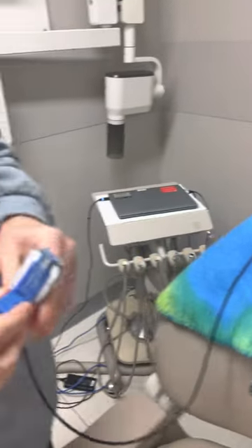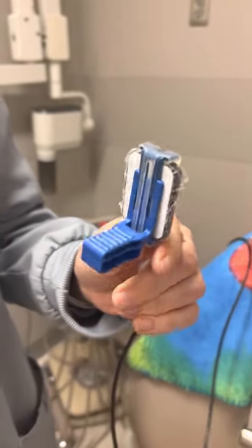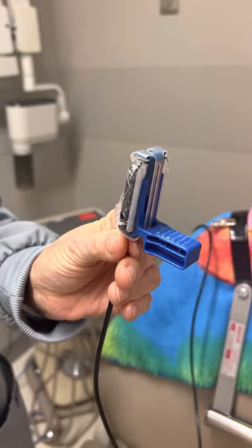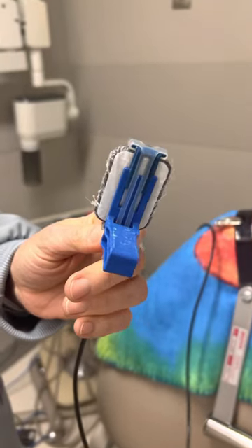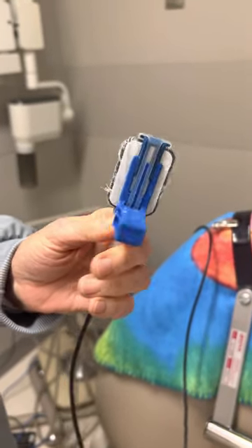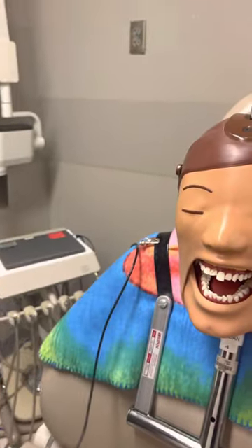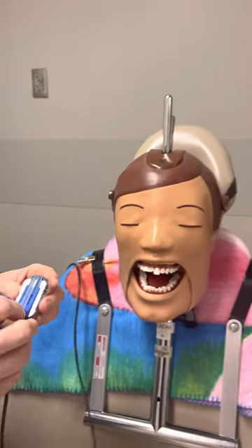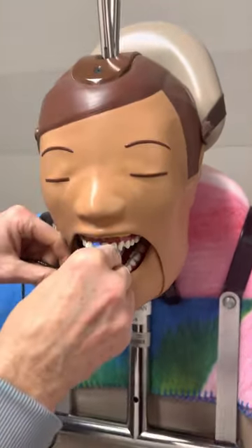We're talking about bisecting. We're going to start with the anterior holder. The anterior holder can be blue or white. You just have to make sure that you check the orientation of the holder. For bisecting, we're not going to have that arm and that ring, so we're going to go into the patient's mouth with just the bite block.